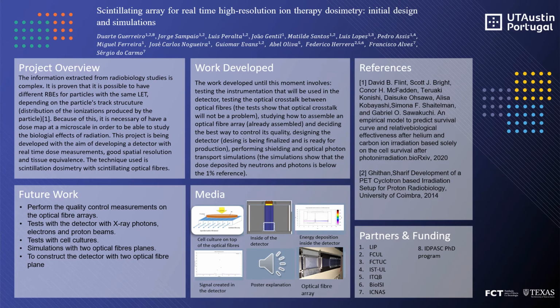The detector's spatial resolution will be a function of the optical fiber's dimensions. And we are planning to work with optical fibers of 1 millimeter, half a millimeter, and a quarter of a millimeter.